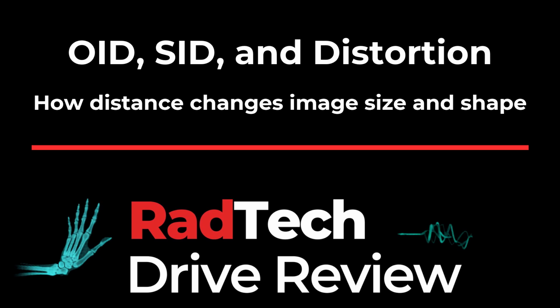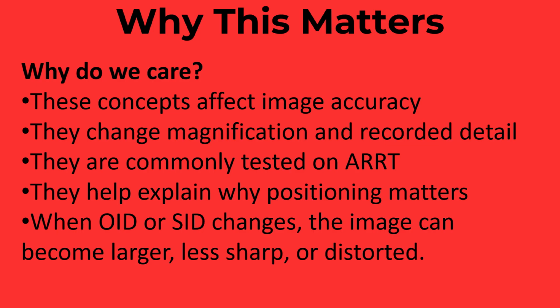In this episode, we're covering OID, SID, and distortion, one of the easiest image production topics to mix up on the ARRT exam. The goal is to remember what changes image size, what changes detail, and how to avoid shape distortion. This matters because radiographic images are not just about getting anatomy on the detector. We want the anatomy to look as true to life as possible. When OID or SID changes, the image can become larger, less sharp, or distorted.